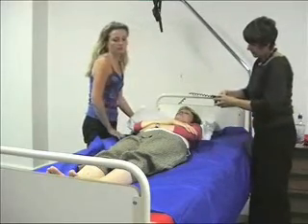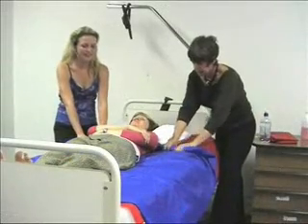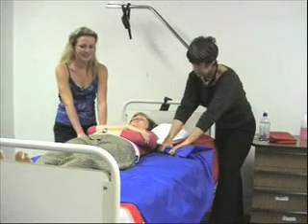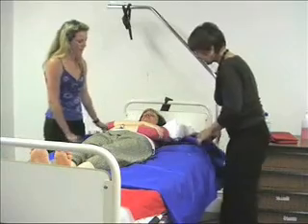When standing to move the patient, your arms should be straight and you should have one leg in front of the other. You should be facing the diagonally opposite corner of the bed. Now you are ready to perform a no-lift repositioning of your patient up the bed.